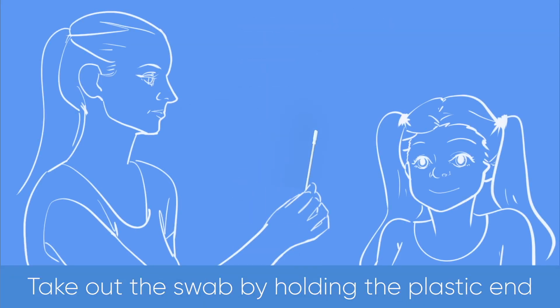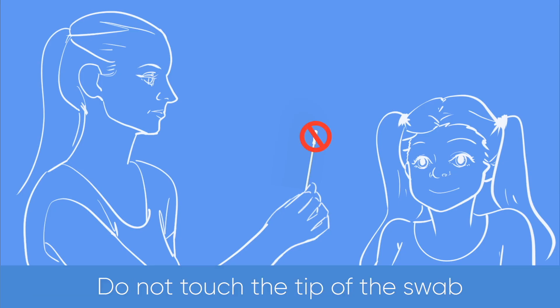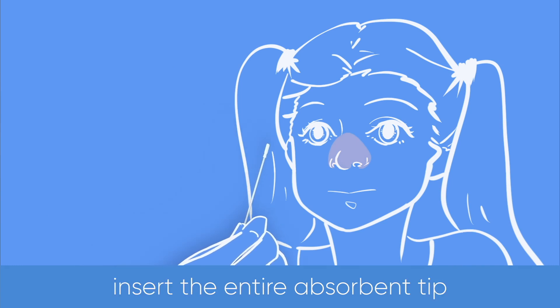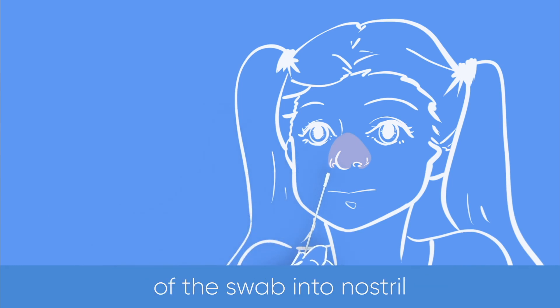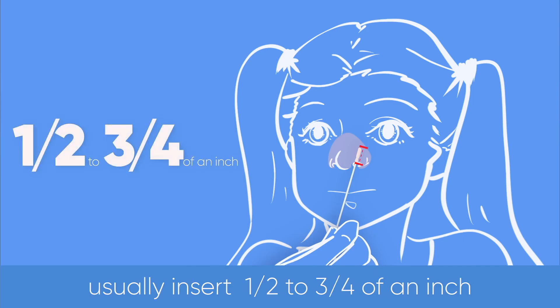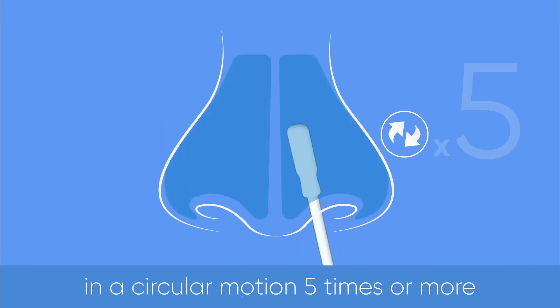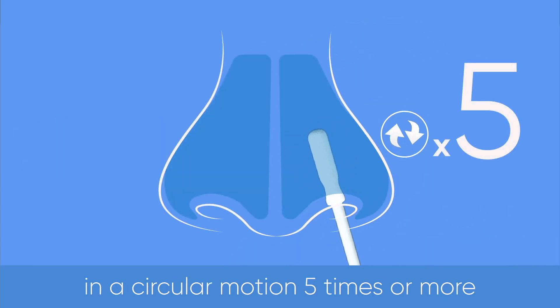Take out the swab by holding the plastic end. Do not touch the tip of the swab. Slowly and gently insert the entire absorbent tip of the swab into the nostril. Usually insert one-half to three-fourths of an inch. Firmly brush against the insides of the nostril in a circular motion five times or more.